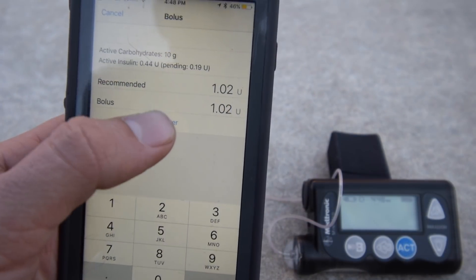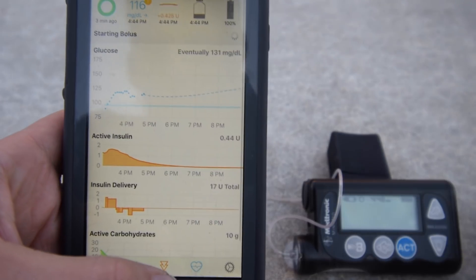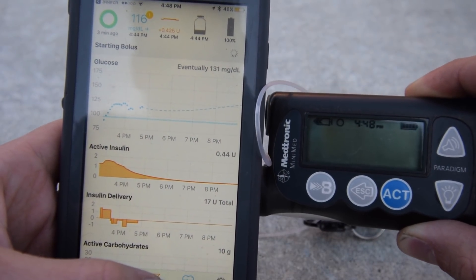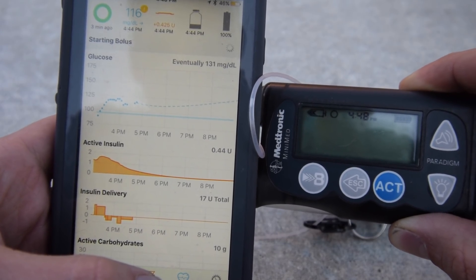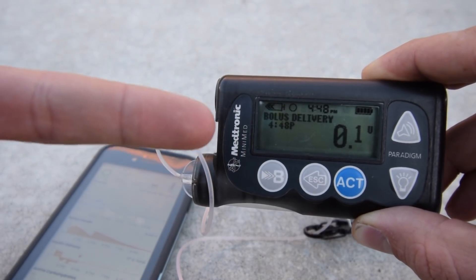Are you ready for this? We hit deliver and I know you don't believe this is possible, but I'm about to bowl this without touching anything. Wait for it, wait for it — and here it goes.